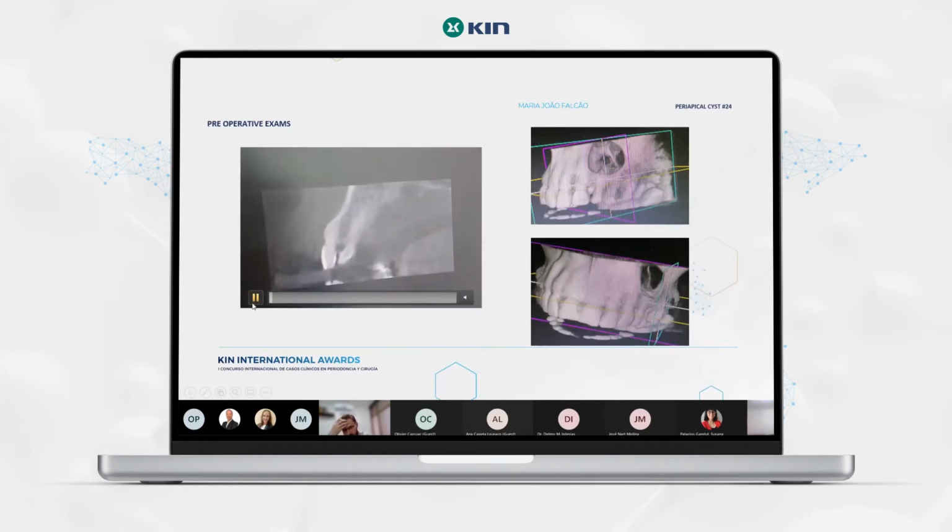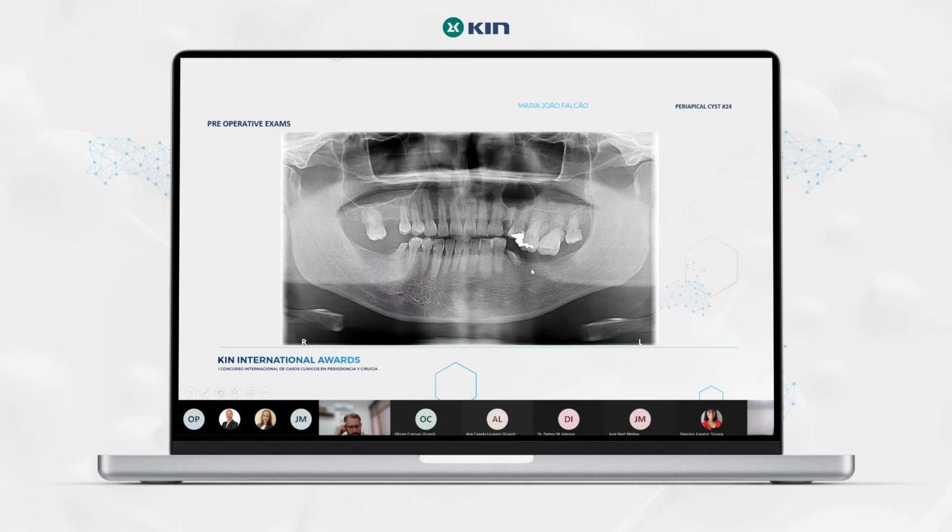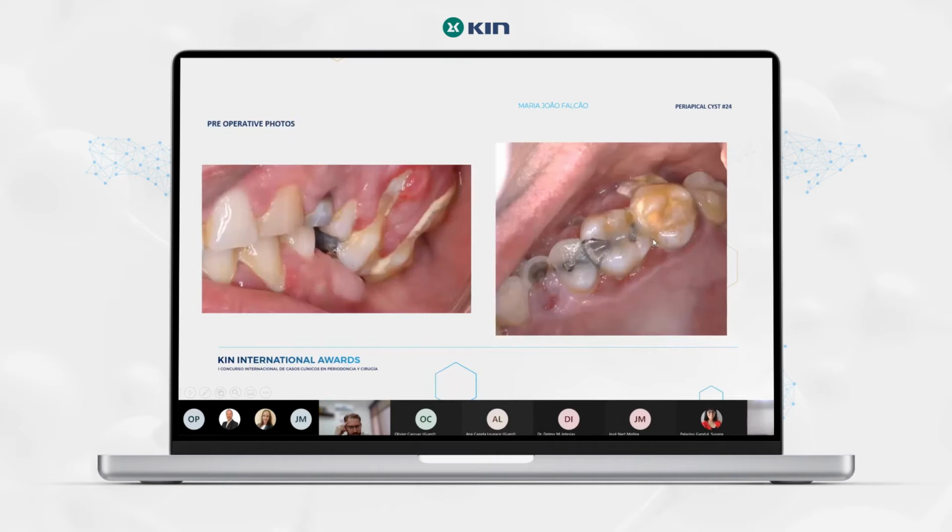And here, this is a video I did from one of the images in the tomography. We can see that we have a small cortical between the cavity of the cyst and the maxillary sinus. So in this exam, we are pretty sure that we don't have a communication. That's good. So we decided, as our treatment plan, to extract all these teeth in the second quadrant. They were not good, as you can see here.